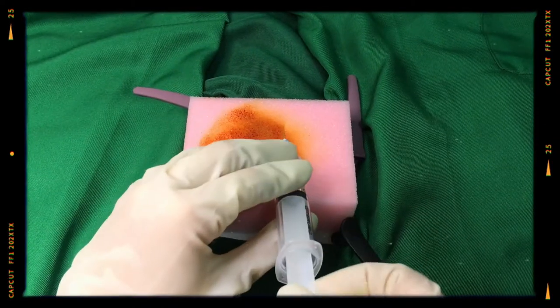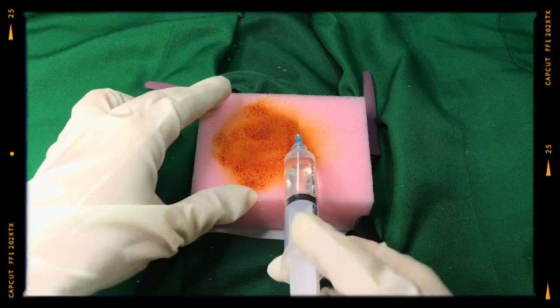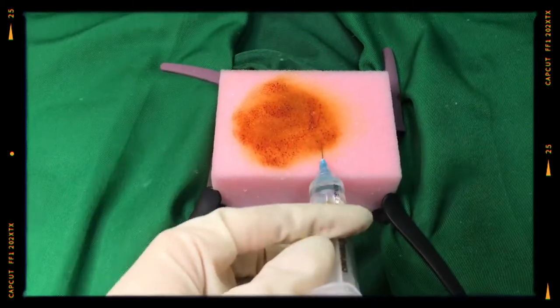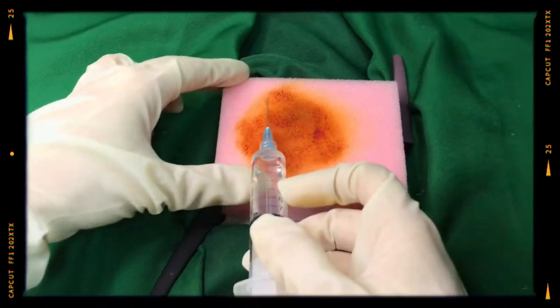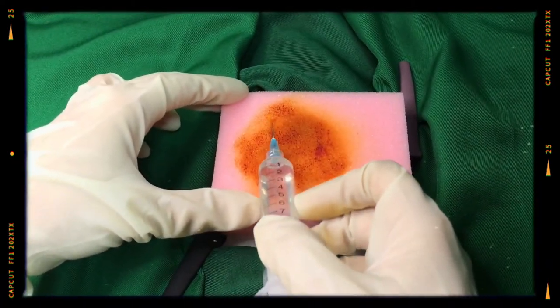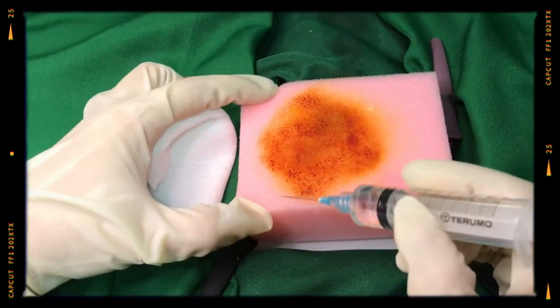Infiltrate the skin with a local anesthetic and block the intercostal nerve branches, the bevel side up of the needle. Don't forget to aspirate before injecting the anesthetic. Infiltrate up to the level of the pleura. Check the effect of the anesthesia using the tip of the needle.